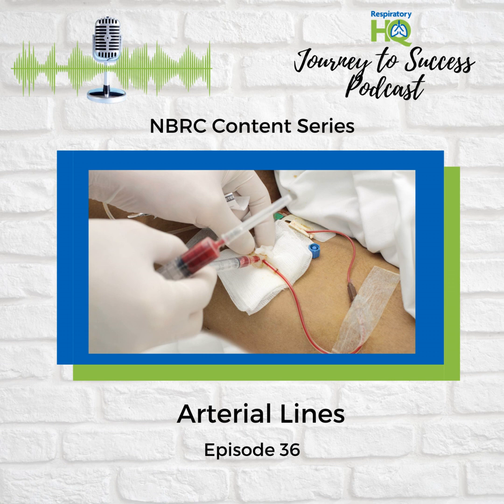And then you have automatic devices, which are convenient, but they can be iffy, like if you're moving around a lot. So what happens if we need constant monitoring, like during surgery or in intensive care? That's where we use arterial lines. Ooh, arterial lines. I've seen them on TV, but I never really knew what they were. You can think of it like a direct line into an artery, usually in the wrist.